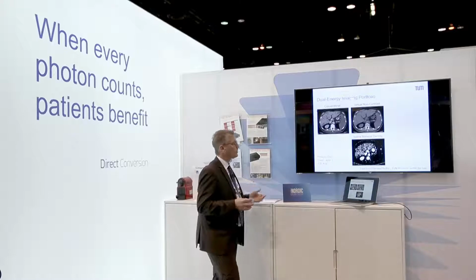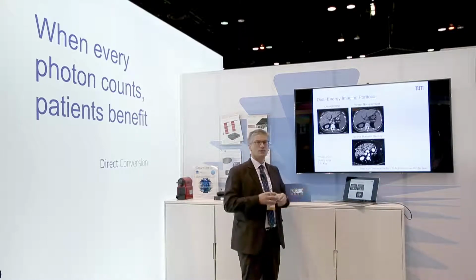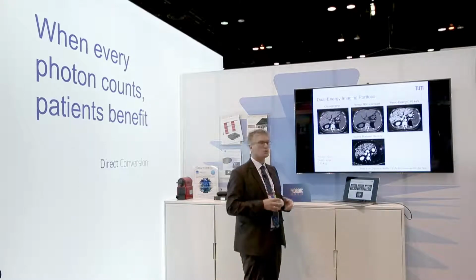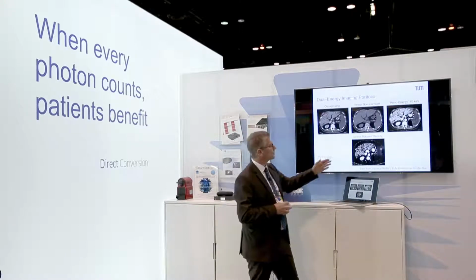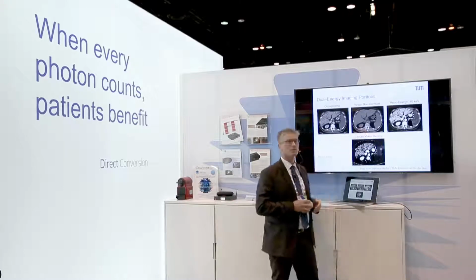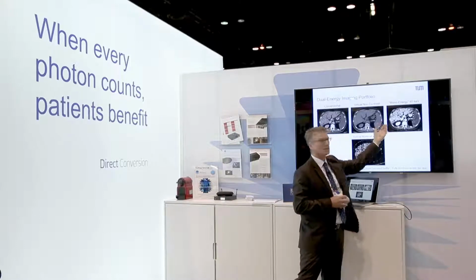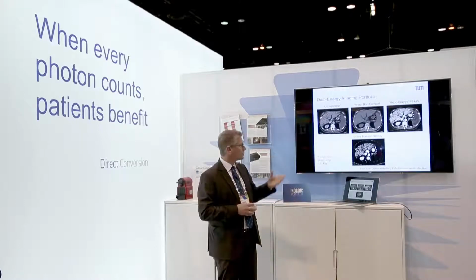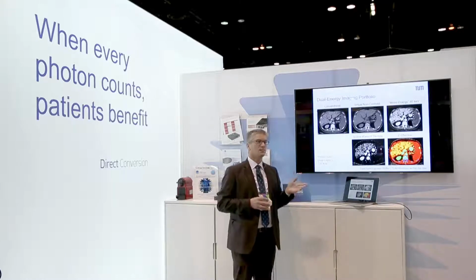You can also use this duality information to calculate other derived images. You can, for example, compose so-called virtual monochromatic energy images. This is a fusion where you have scaled the photo and Compton effect contributions to a relatively low energy at 40 keV, which actually enhances the soft tissue contrast by using energies that are quite low.